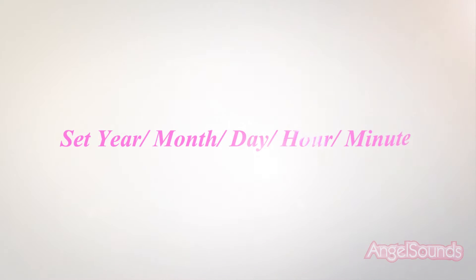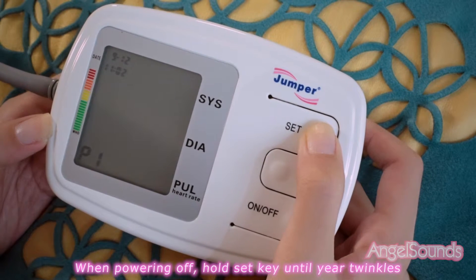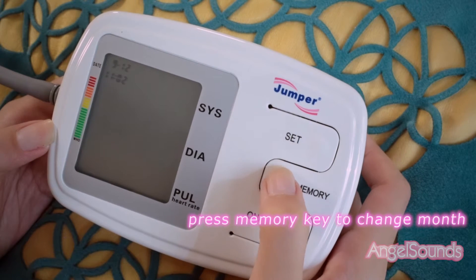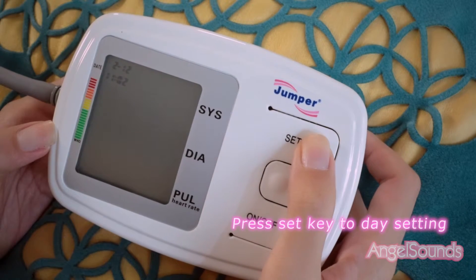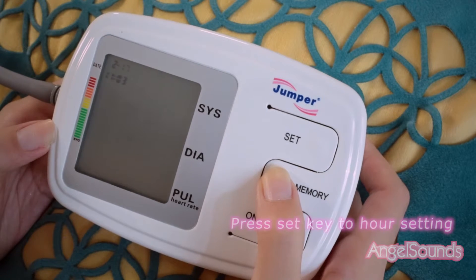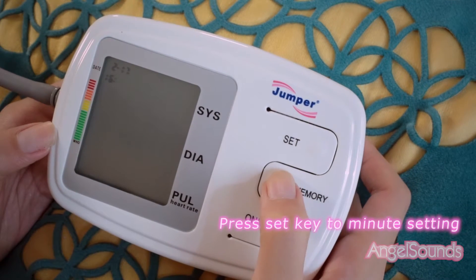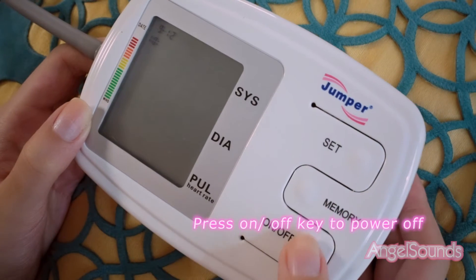To set the year, month, day, hour, and minute: when powered off, hold the set key until the screen twinkles. Press the memory key to change the year, then press the set key to go to month setting and press memory key to change the month. Press set key to day setting and press memory key to change the day. Press set key to hour setting and press memory key to change the hour. Press set key to minute setting and press memory key to change the minute. Press on-off key to power off when done.